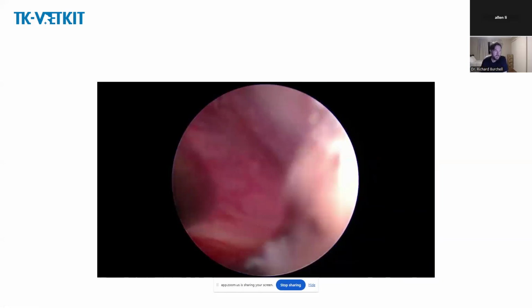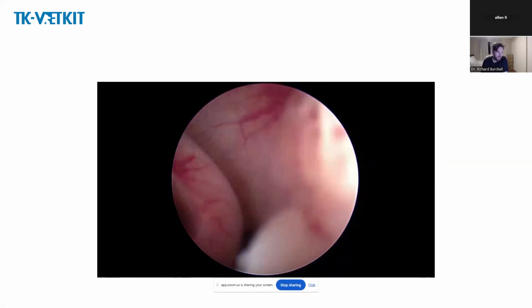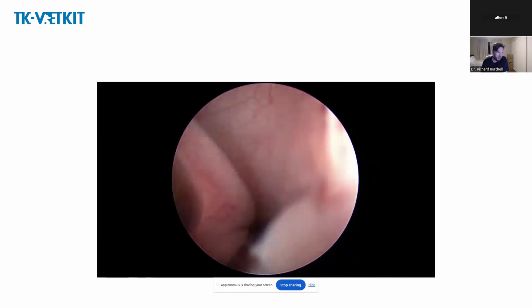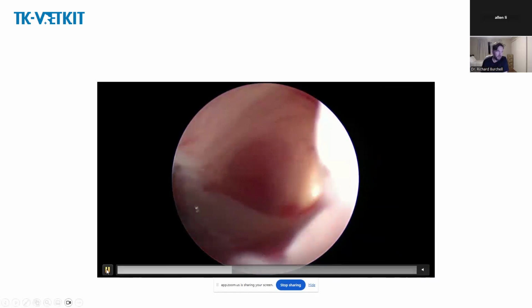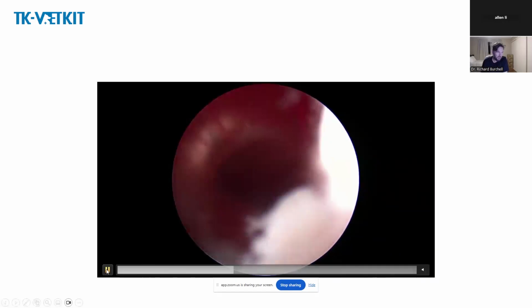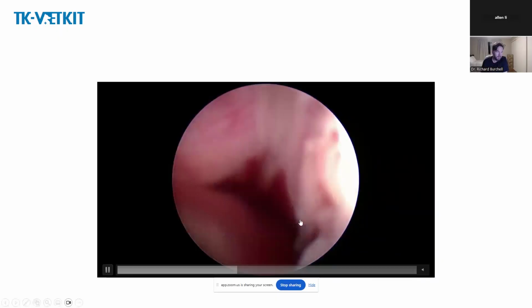And so you can see we're now through to the nasopharynx, but it's nothing like as advertised, because we've picked up some nasal tissue, and we've got some exudate, we've got some bleeding, we've got a bubble, but we're in the opening to the nasopharynx, and now we've got some bleeding.